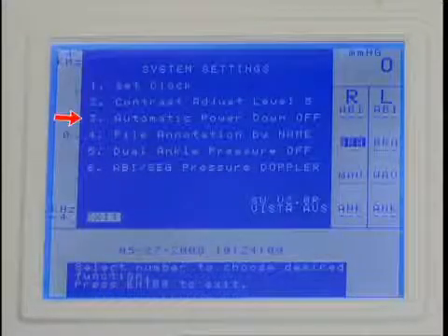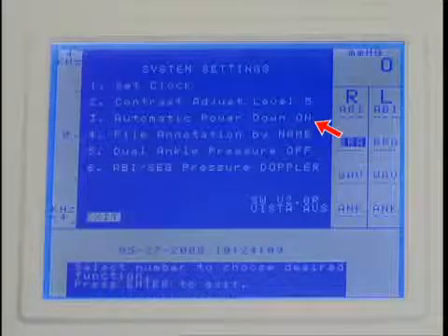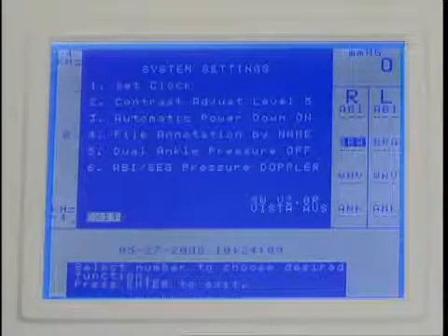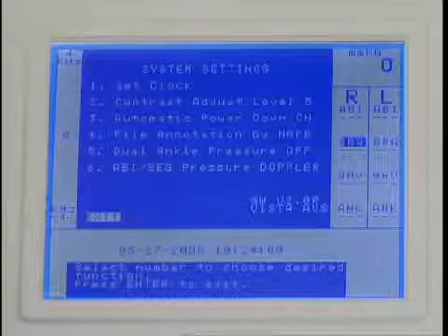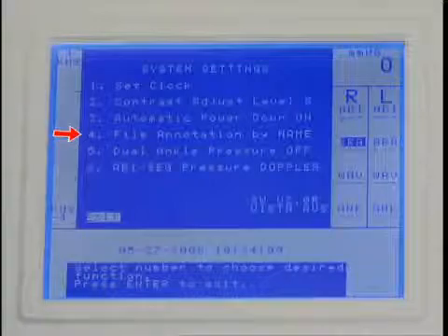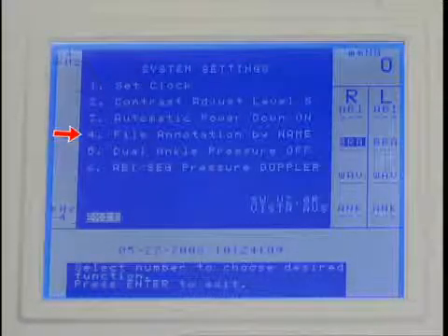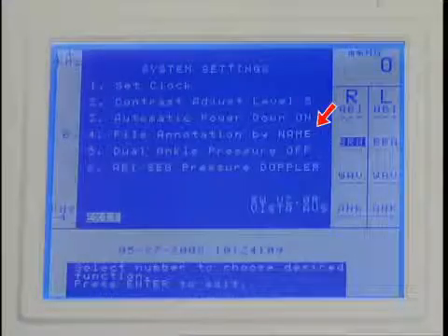The third setting is automatic power down. Press 3 to change the power down setting. When enabled, the system turns off to conserve battery power if it has been idle for 20 minutes. File annotation is the fourth setting, which controls the creation and saving of file names using either numeric or alpha characters. Press 4 to toggle between number and name.